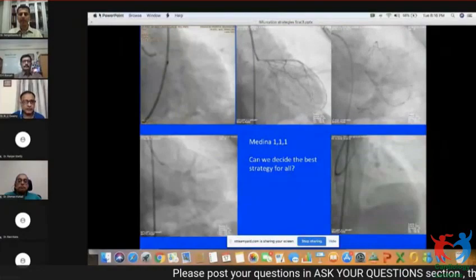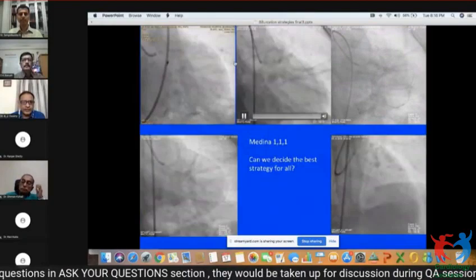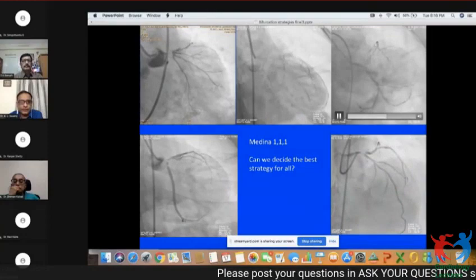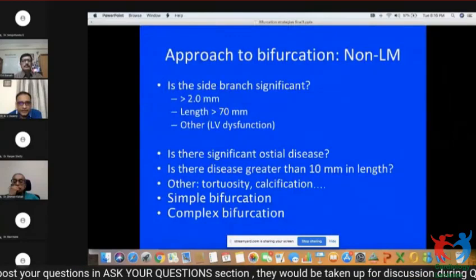Okay. So, thank you very much for your attention. We see these different kinds of anatomies. All five different cases, all of them are Medina 111. Can we decide the best strategy for all? And that is going to be the focus of our talk. What are the strategies for bifurcations in our normal daily life?